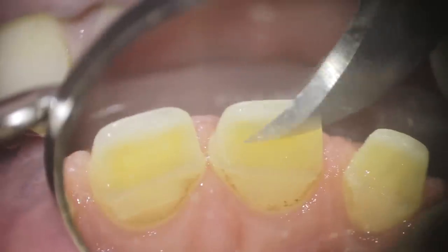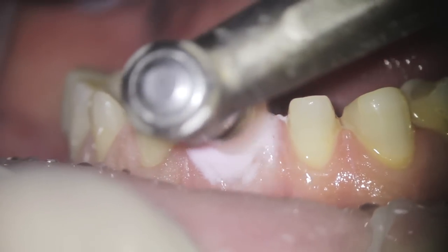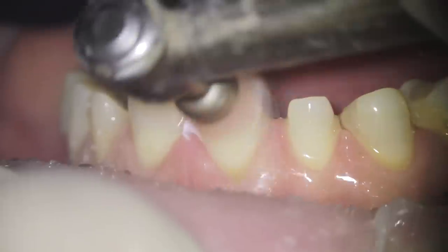Deformation and distortion are the worst enemies during the impression. You want a rigid tray or a custom tray. You must inspect the impression very well, because if you cannot see the margins, the lab won't see them either. A good lab can make a great restoration if they see the margins, even if the preparation isn't perfect. But even the best lab in the world can do nothing with a bad impression. So inspect it carefully, and if there are areas where you cannot see the margin, just redo it — it will make your life easier.